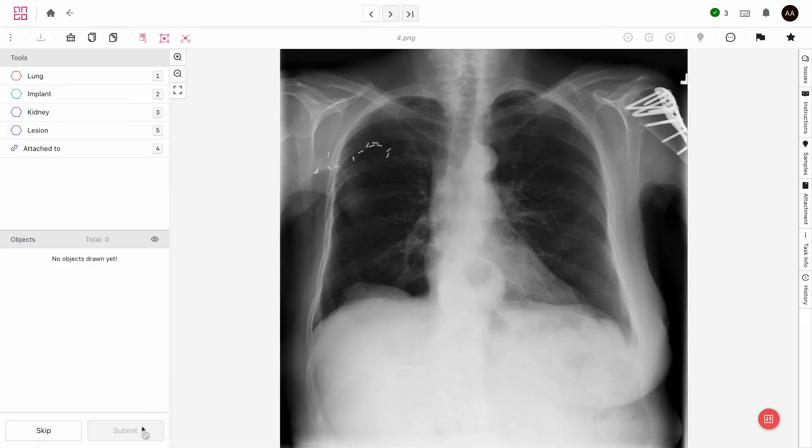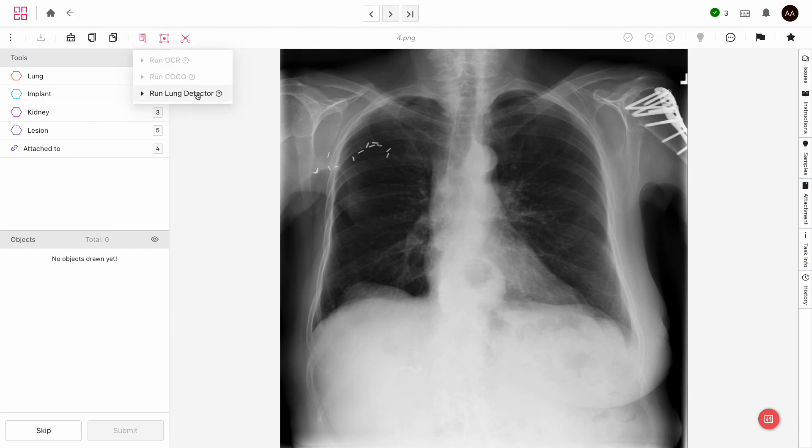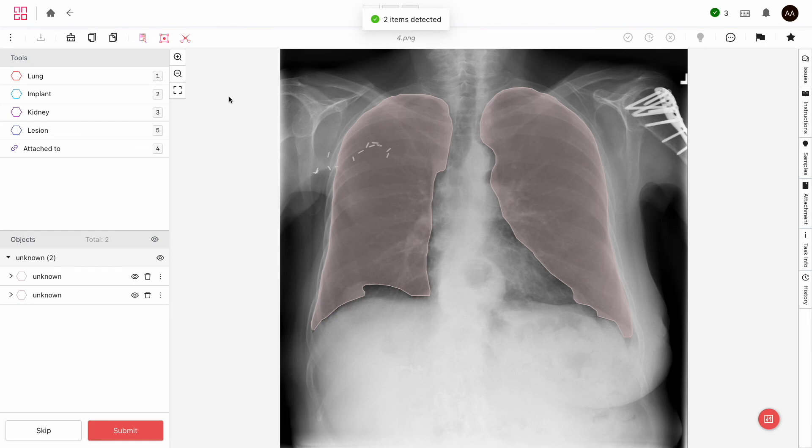So here's a typical chest x-ray. If you're a radiologist, you've seen these thousands of times. We are developing models to help labelers annotate these types of images quickly and efficiently. Right now, we have one specialized model for medical labeling with many more in the pipeline. Say we wanted to quickly label the lungs in the image, all we'd have to do is click on Lung Detector here, and it's done. If it's necessary to make adjustments, all you need is to move some points.